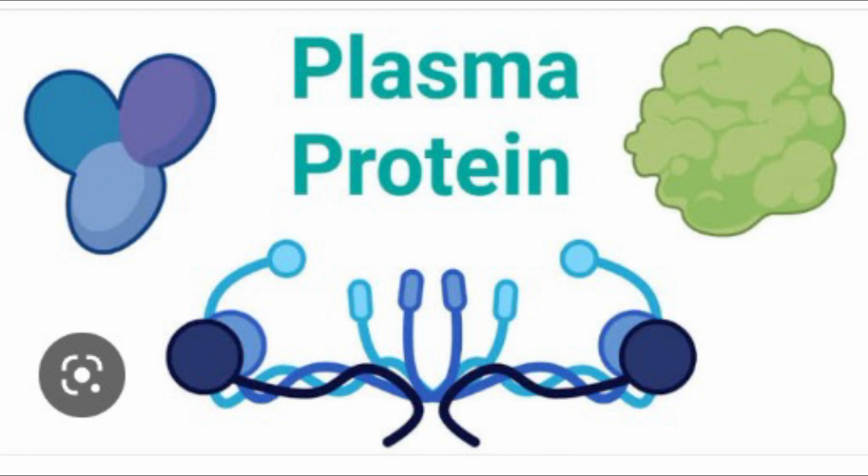Test for Bence Jones protein. Bradshaw's test. This is a preliminary test for BJP. Concentrated HCl is taken in a test tube to which urine is added drop by drop. If a white ring is formed at the junction of the two fluids, it indicates the presence of Bence Jones protein. If the albumin is high, then also a ring is formed, which is a false positive. So to confirm the presence of Bence Jones protein, the heating test is performed.